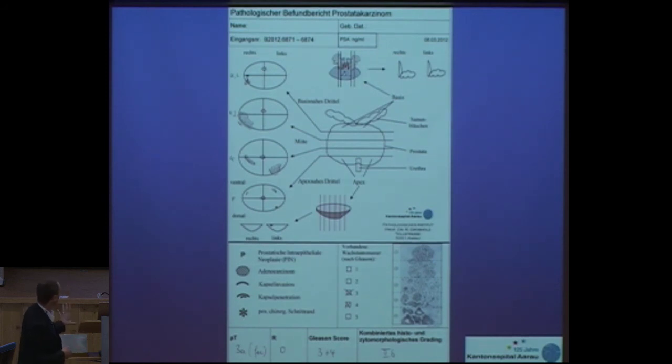an overview and a sketch of the prostate cancer diagnosis. We give you a little impression of how the tumor is distributed throughout the prostate, and together with the measurements, you may have an overview of how to treat your patient and what the most likely prognostic value can be. So I could stop here if I'm over time. Thank you very much.